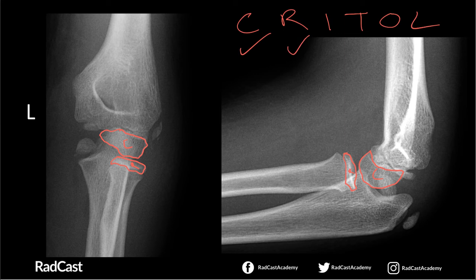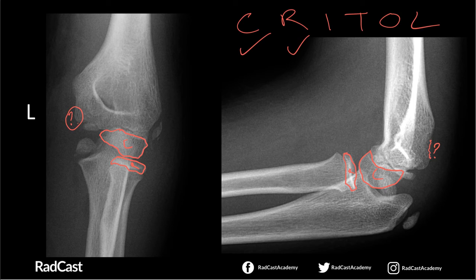Next: internal or medial epicondyle. Something should be here where typically the medial epicondyle is, and on the lateral it should be around here. I'm a bit worried — there's quite an irregular border. Let's park that. We've got a case of a missing internal or medial epicondyle. Moving on: T is for trochlea, and yes, I can see the trochlea ossification centre here on the frontal view and here on the lateral view.